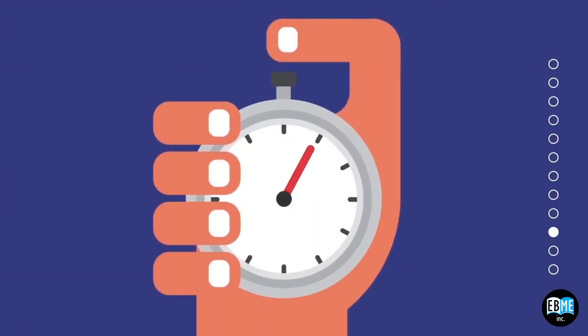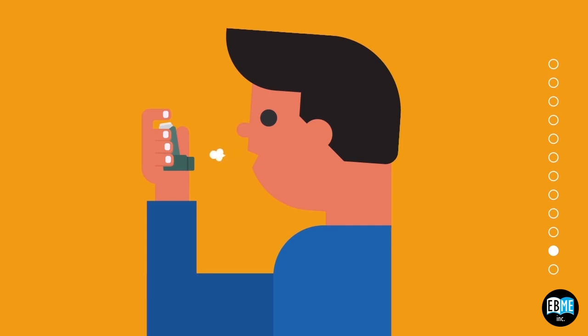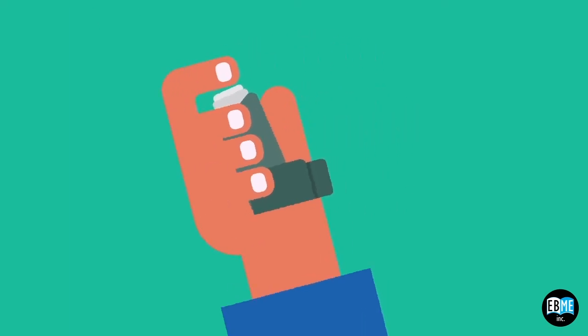Hold your breath for 10 seconds, or if unable, for as long as you can. Remove your MDI from your mouth and exhale slowly away from your inhaler, and replace the cap on the mouthpiece to keep it clean. If you need a second dose of medicine, wait 30 seconds and shake your inhaler and repeat the steps from the beginning.